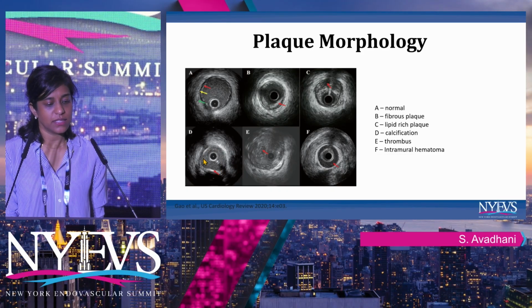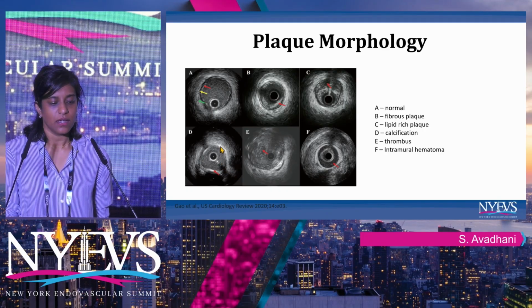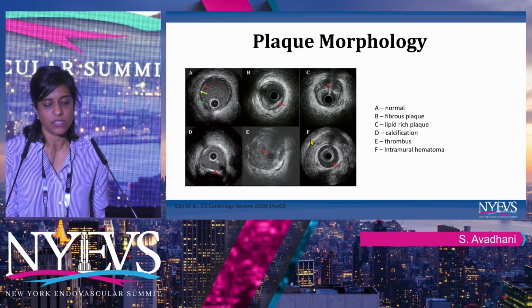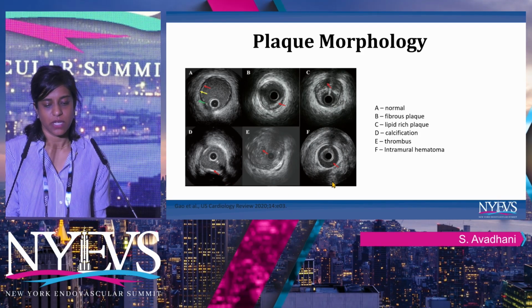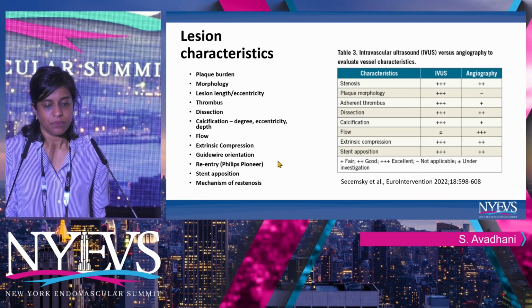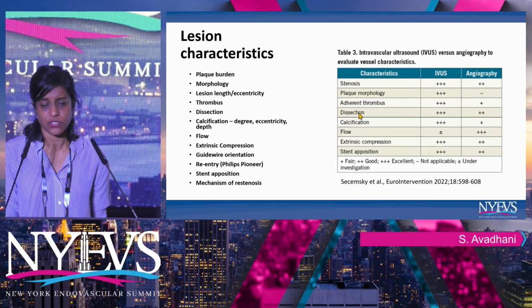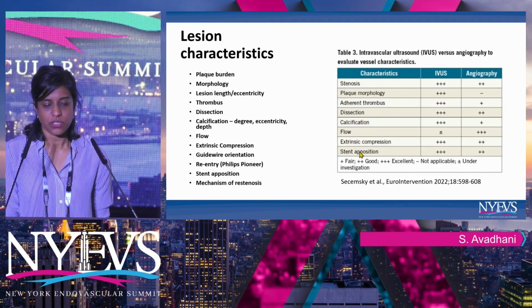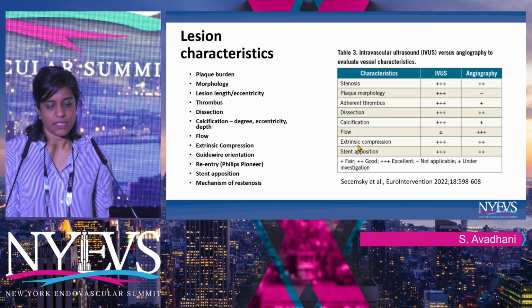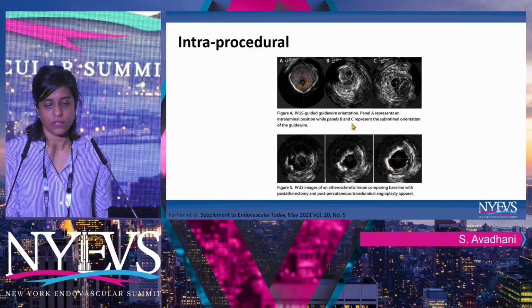Obviously, the amount of calcium and the burden of calcium also dictates what techniques or additional plaque modification tools you're going to use for your interventions, and also to visualize any complications such as intramural hematomas, as shown here in F. IVUS supersedes angiography in identification of not just your lesion, but also your stent apposition, and also dissections and things like that as well.